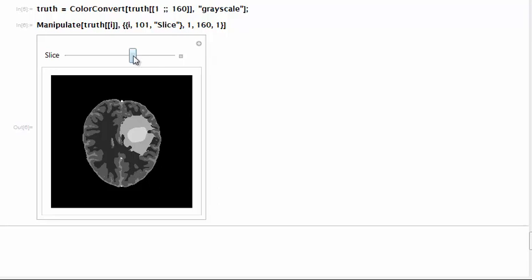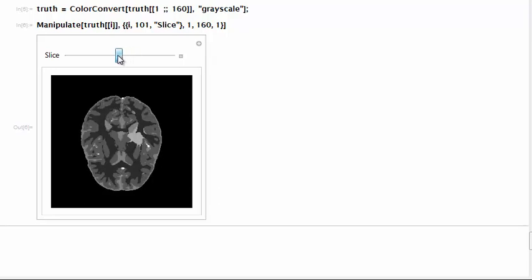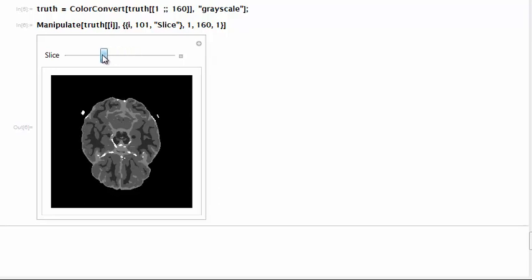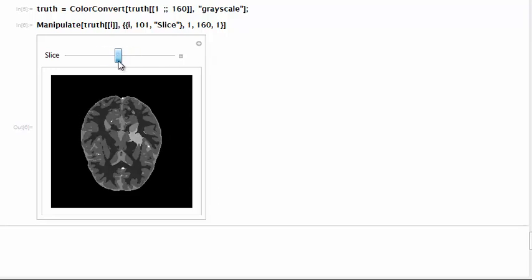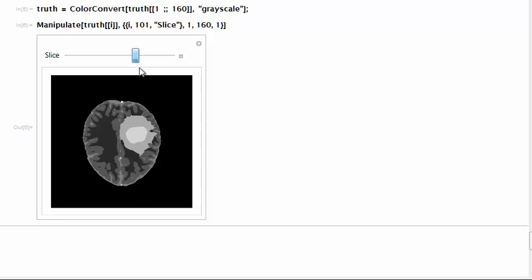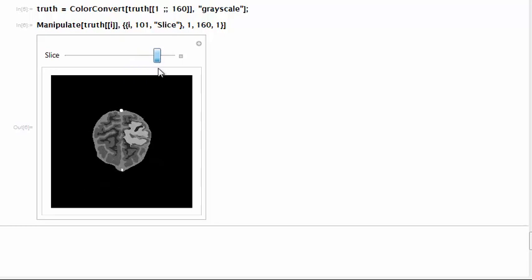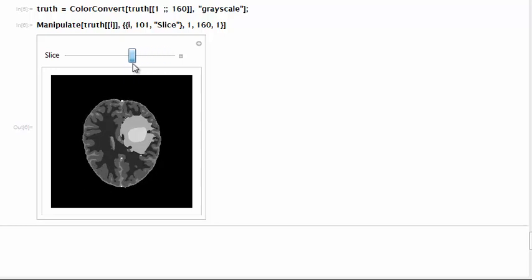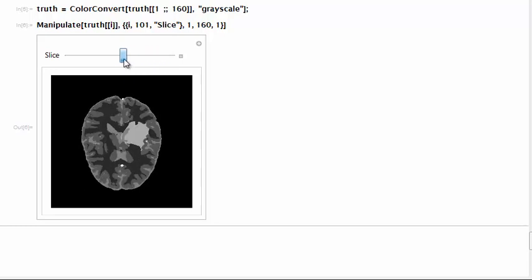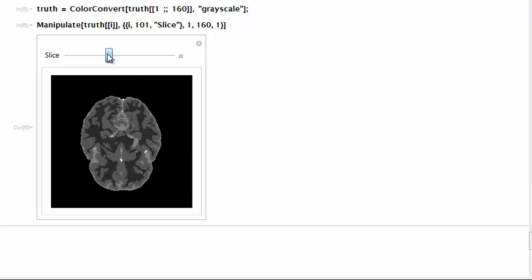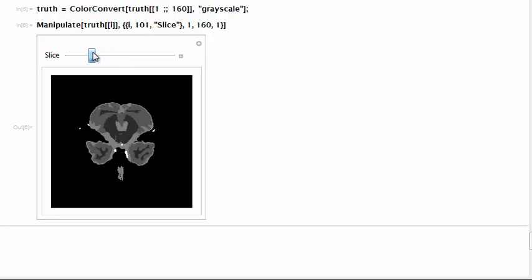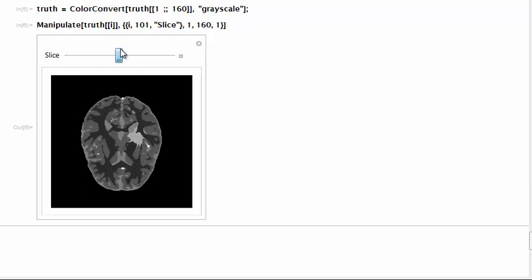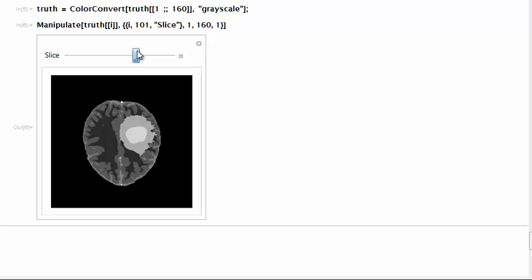We have distinct labels for every tumor and edema voxel. We see them as these pure gray levels that are shared throughout the whole volume. Each gray level represents a distinct class of tissue.